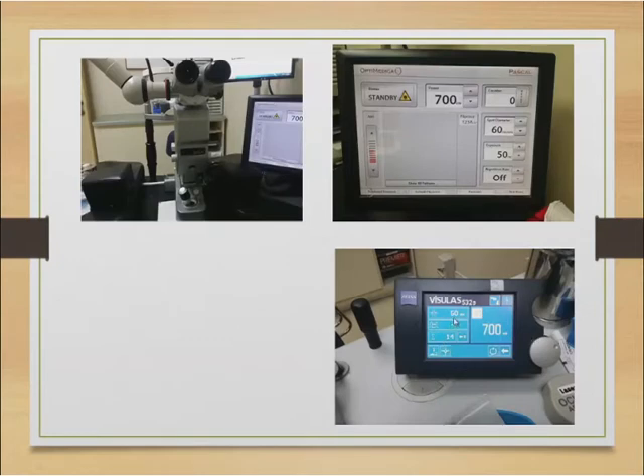Here is the diode — again, 50 milliseconds. On the eyepiece itself you can adjust the spot size, which I would suggest setting to about 50 micrometres. Again, you have 700 milliwatts here, and this is the number of shots. You're aiming for about 10 to 20 shots.